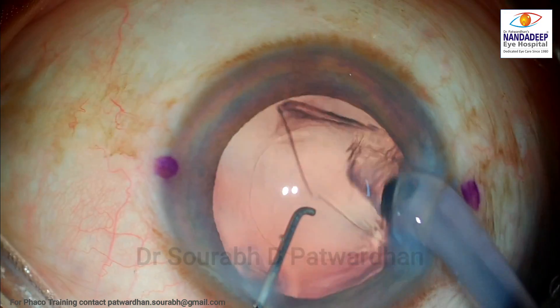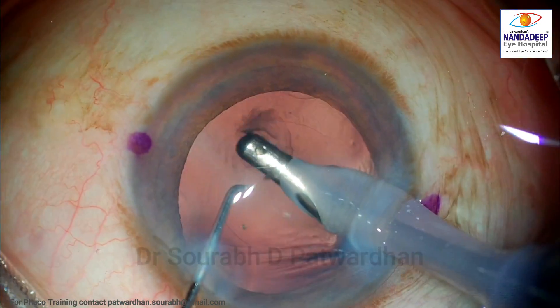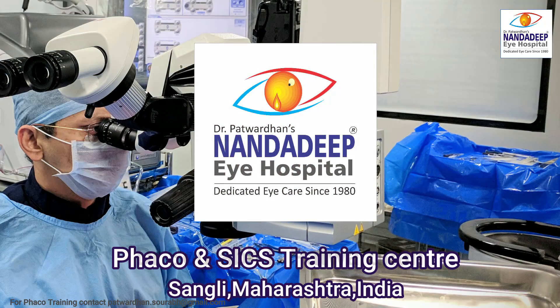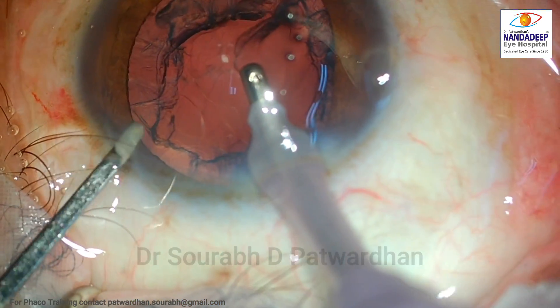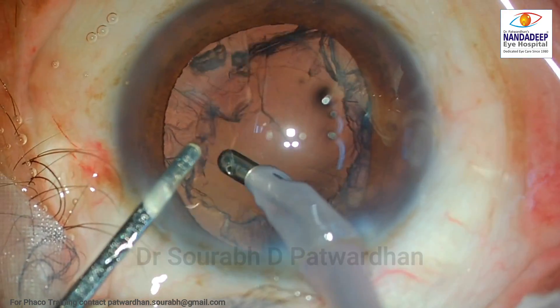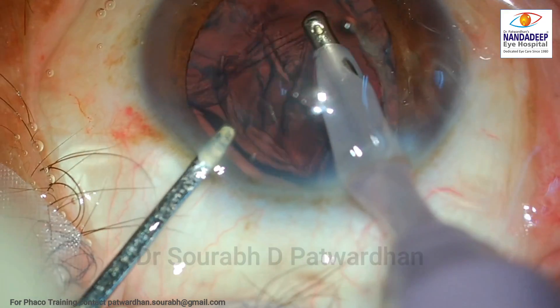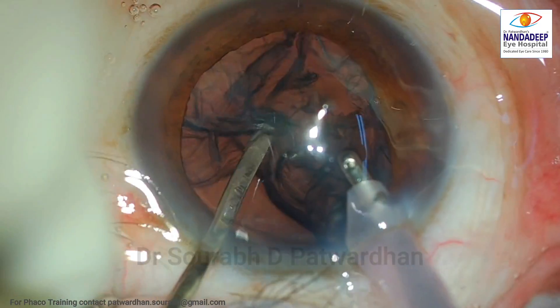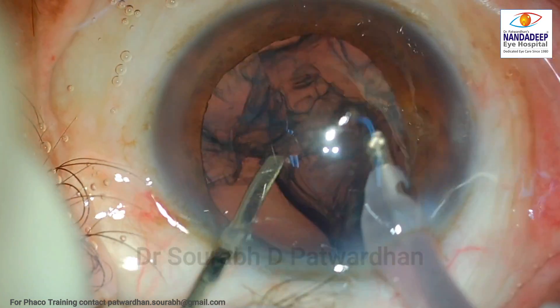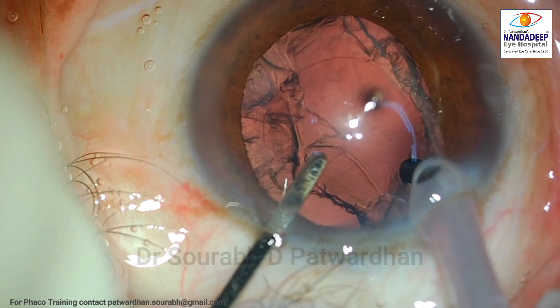For the sub-incisional, watch carefully. The irrigation should always stay in the anterior chamber. Use low vacuum, engage the cortex, don't hurry, and don't use very high vacuum in the periphery. Now let us have a look at another surgeon's video and you will find why these concepts are very important. The planning has to be there and the steps have to be followed properly. Watch here — the IA probe is getting withdrawn in between, whereas the IA probe should always stay in the center.